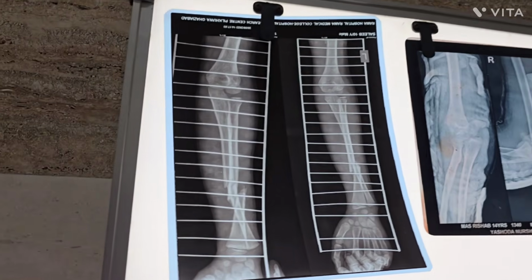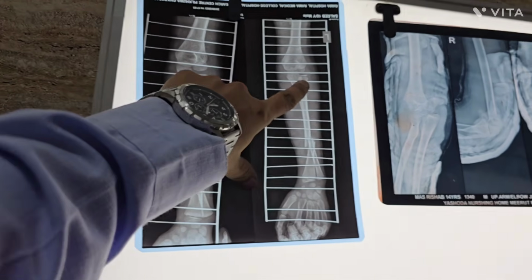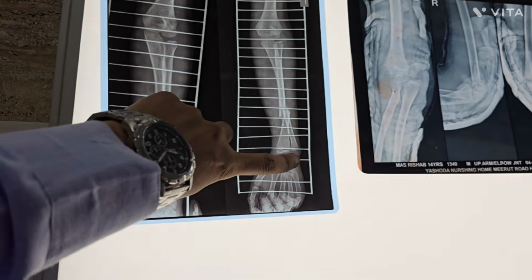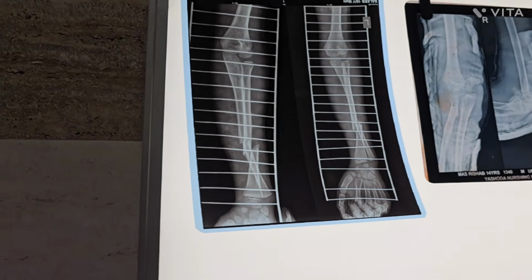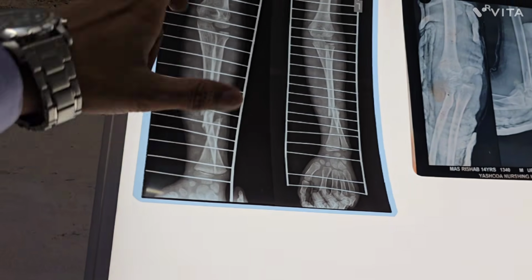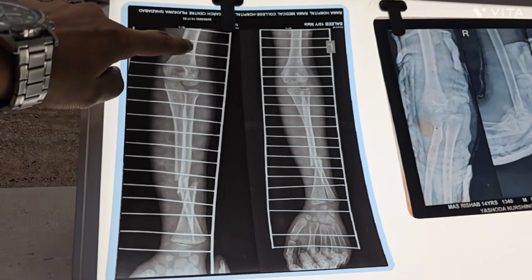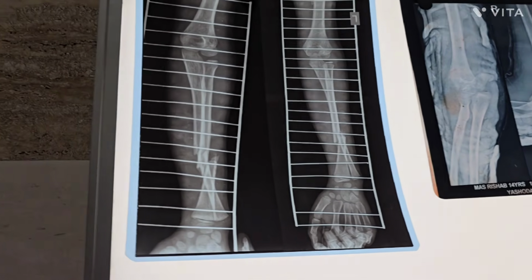So now the next X-ray. Why is it a skeletally immature X-ray? You can see the physis. All these physes are not fused. So this is a skeletally immature patient's forearm taken in AP and lateral view with adequate exposure with the Kramer wire support, showing the distal part of humerus, radius, ulna, carpals and metacarpals.